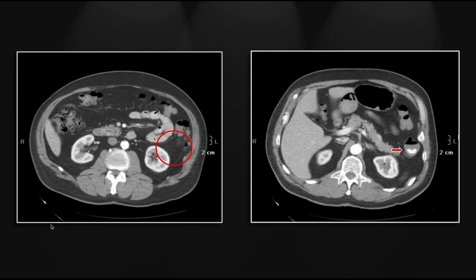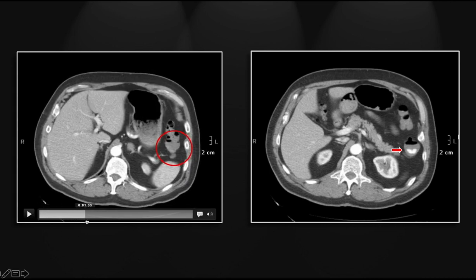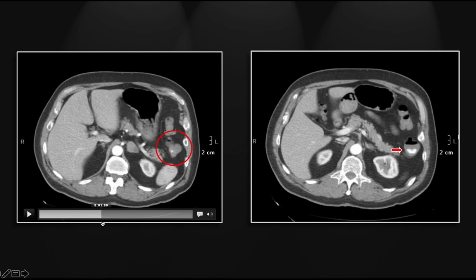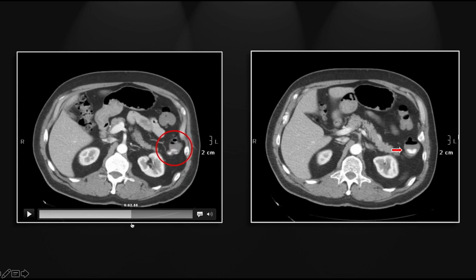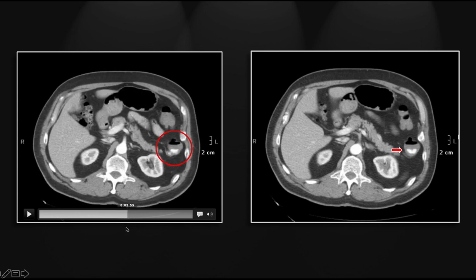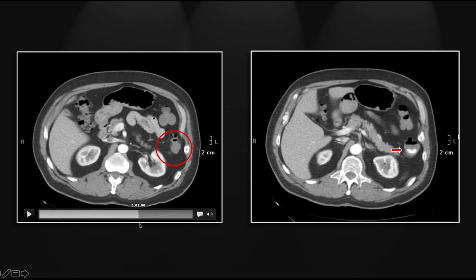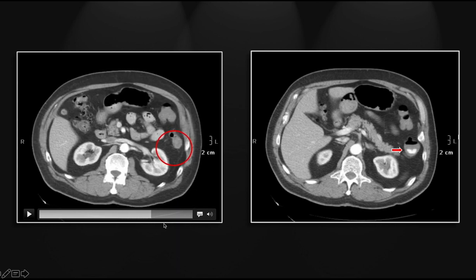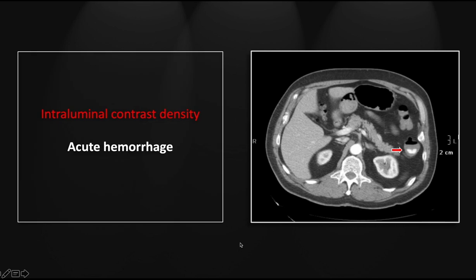It can be just a quick flash — if you blink, you miss it. So that's what you're looking for: a small focus of intraluminal contrast extravasation. That's acute hemorrhage involving the descending colon.